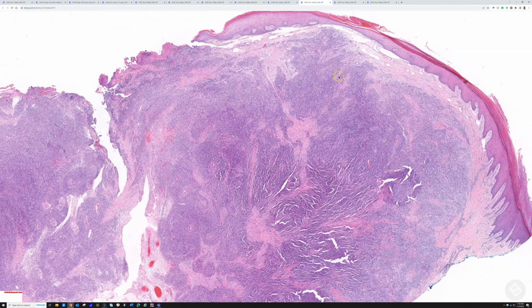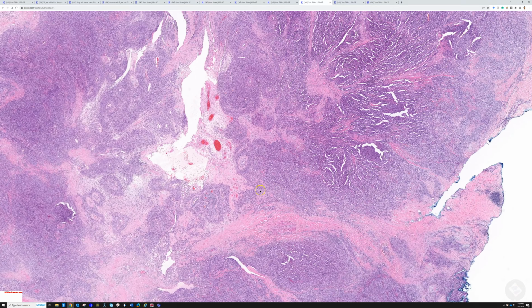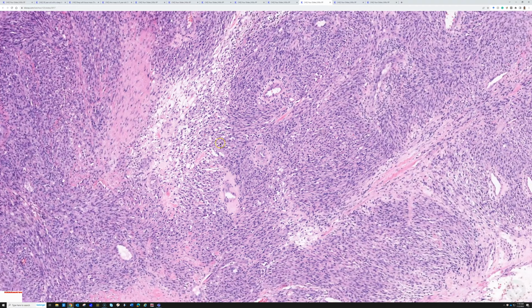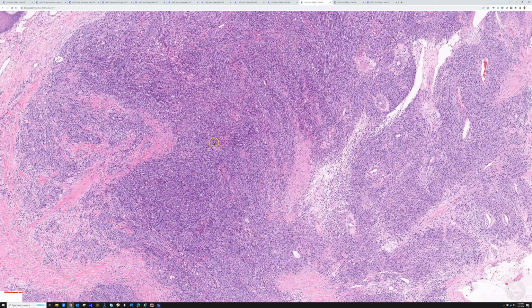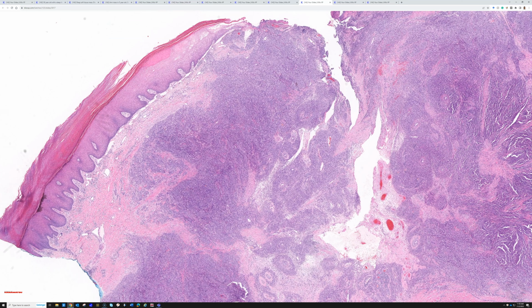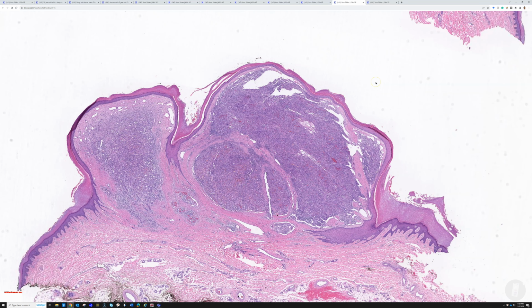So just remember that not all vascular tumors have blood, and if in doubt, do some vascular markers. If you're thinking of Kaposi, do an HHV8 stain. And this was a case that I'll always remember because of how tricky it was when the erythrocytes are not present. And then finally, we'll finish up here with a last quick little case. So I showed you this one already.